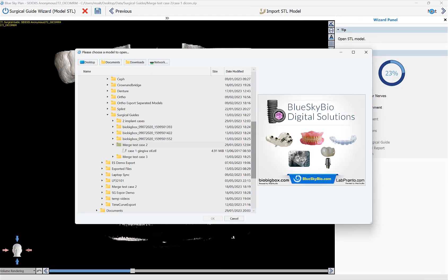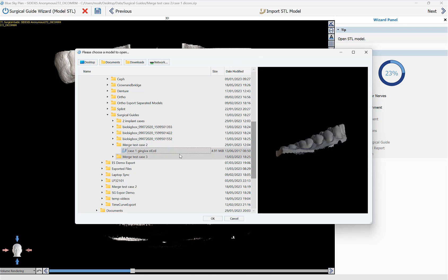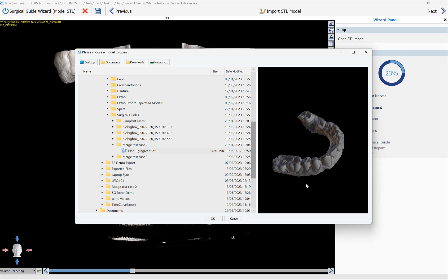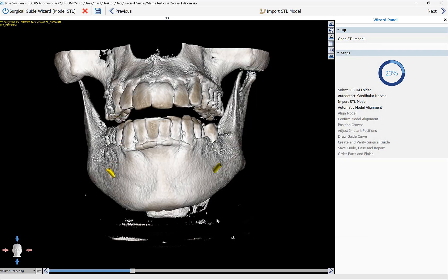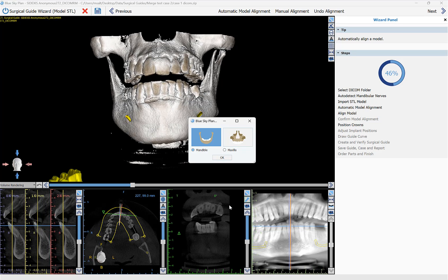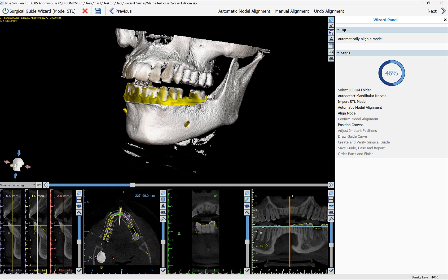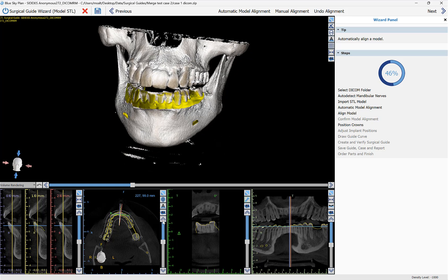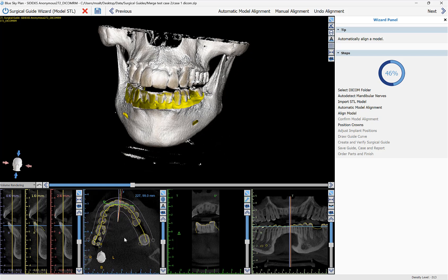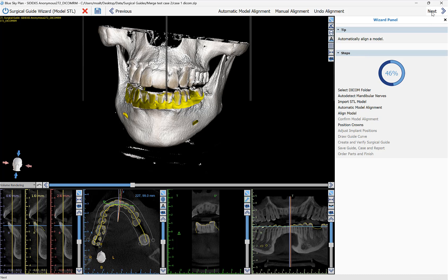The software now prompts us to load the relevant model scan or STL file. Simply left-click once on the relevant file — you can see a preview on the right side of the screen, grab and drag with your left mouse button — and then click OK. Let's indicate Mandible. The software is now running completely automatic model alignment, aligning the model to the CT scan. We can confirm the alignment in our 3D and 2D views by checking that the yellow outlines of the model are tightly wrapped around the CT scan in all views, then click Next.